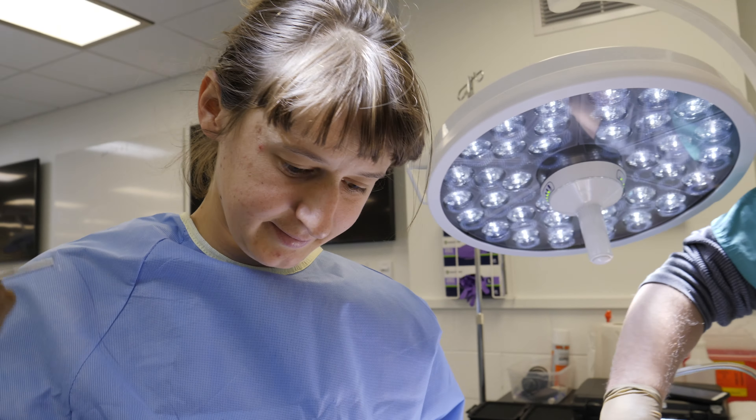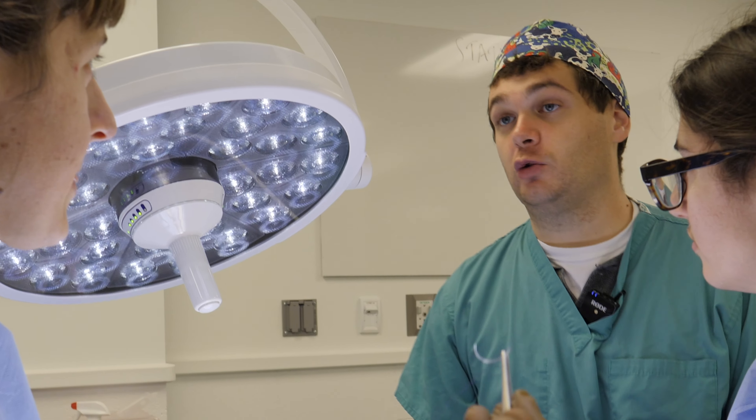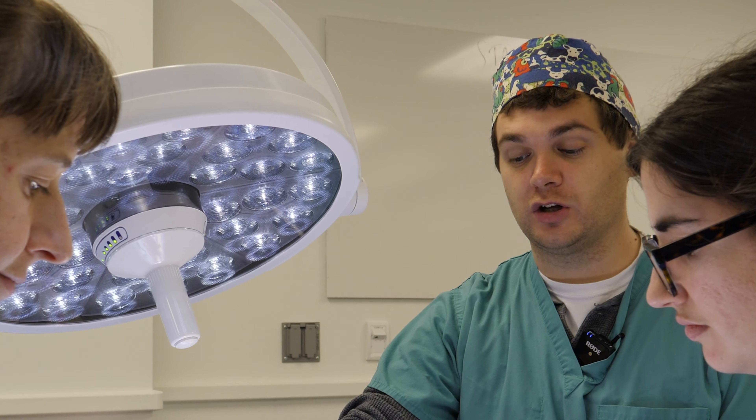That was really good. You guys identified the major bleeding pedicle. The only thing I would say is, instead of going directly in with a hemostat, start with the balfours — get in, improve your visualization, so you can truly see what's going on. We were looking for the source of bleeding and we found it. It was our dropped pedicle on the left side. We isolated the bleeding, got a chance to tie it off, and checked everything else as well. Dog is alive — or never was alive — but it's fine.